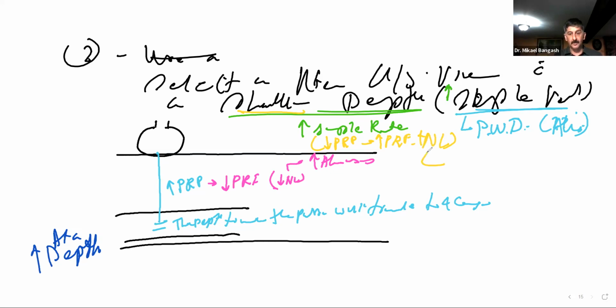And by doing so, mainly because of our sample window here, not the depth of your image, but your sample window, you will have less aliasing, or you get rid of aliasing.